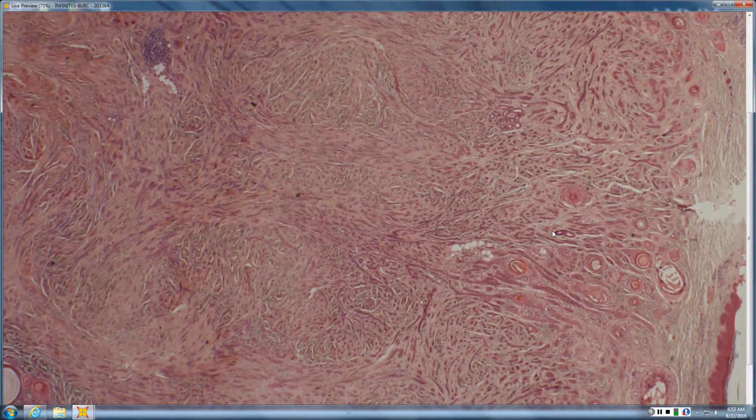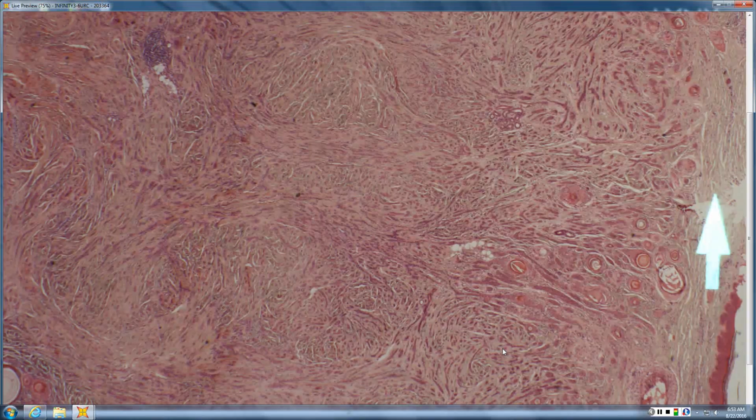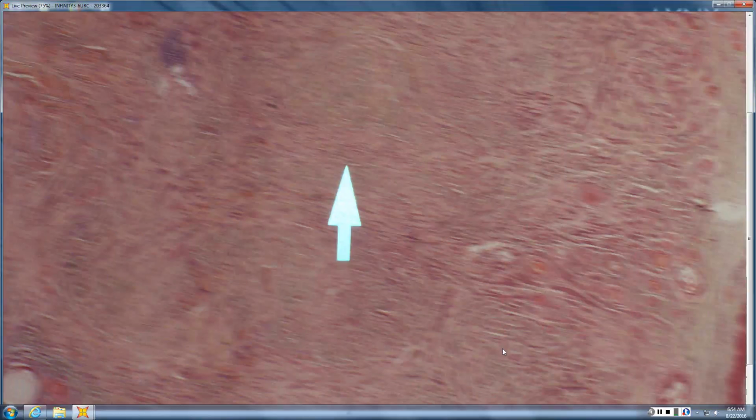And morphoeic basal cell can have all three of the things we've been talking about: horn cysts, ducts, and calcifications. So that doesn't necessarily help you. And same thing with the MAC. But with the MAC, you usually have both the sweat gland proliferation and the pilar component. So that's a microcystic adnexal carcinoma.